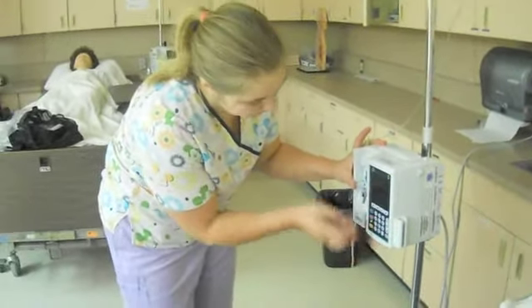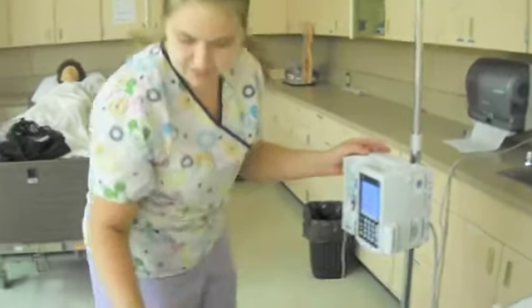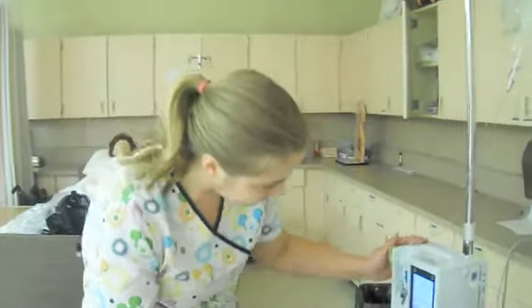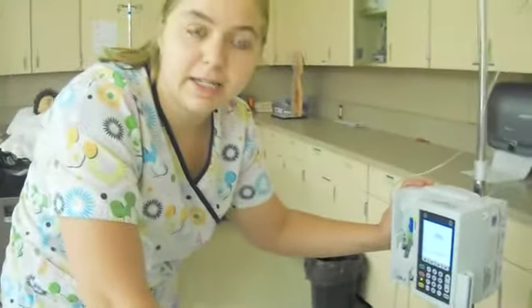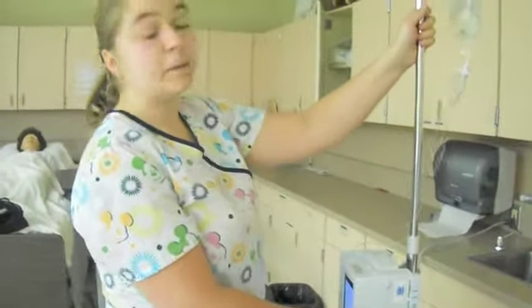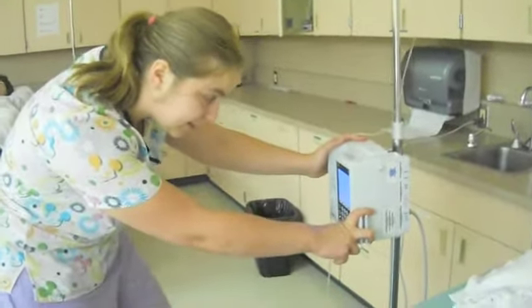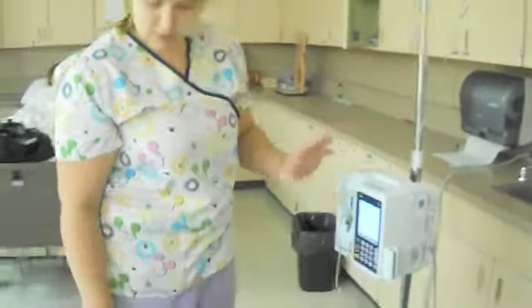I'm just going to set this in the machine and turn on the machine. I had an IV running before so I knew it was patent, so there was no need to check it. If you didn't know the status of the IV site, it would be very important to flush it with normal saline just to make sure it's patent. So now we're going to push A for the main line. I checked the doctor's orders three times and he wanted it at 150 milliliters per hour, so I'm just going to set this at 150. And you're going to set the amount to be administered — it's a 500 milliliter bag, so I'm going to put it at about 450. I'm going to start. It tells you right on here all the amount and how long it's going to take. So right now he has his IV running good, he's in no pain.